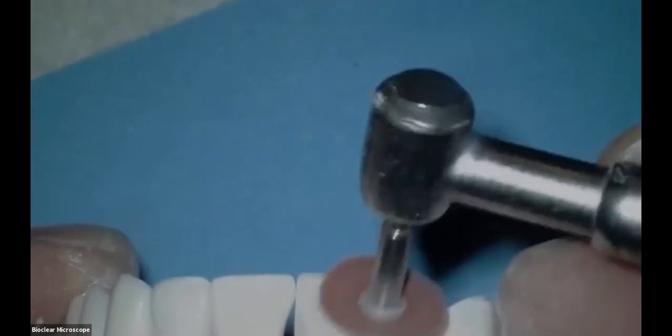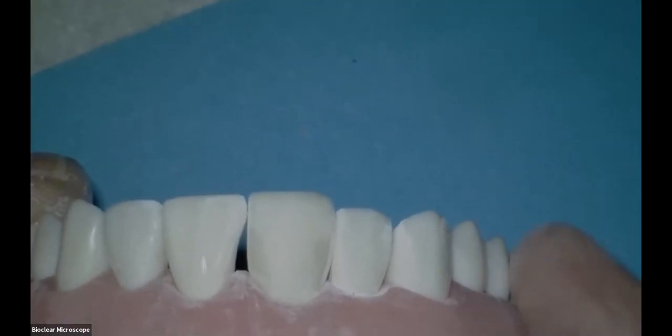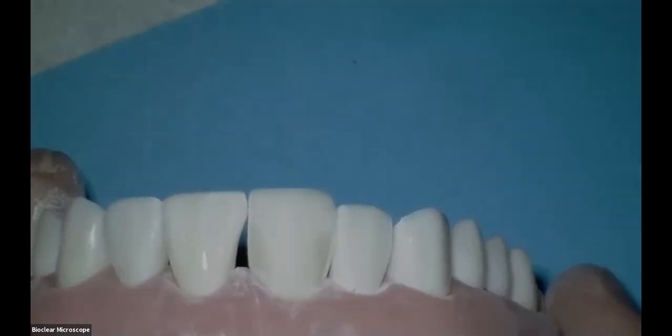Now, of course, I'm going to be doing other teeth later, but like I said, I wanted to show you the process for a single tooth. And now we have the magic mix. So then we'll bring in our magic mix. Now, normally I would be doing the entire quadrant.